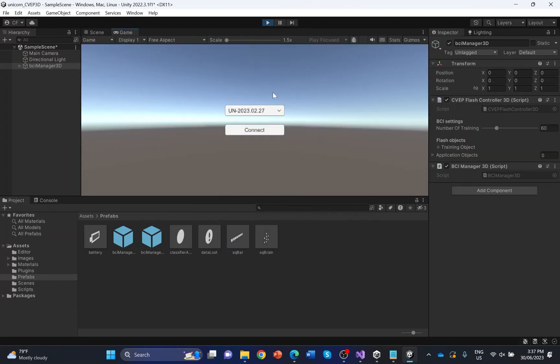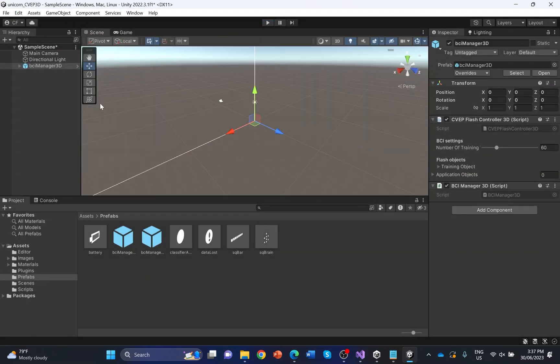You should see the BCI settings, as well as a dialog for training and application objects. To implement a BCI, you will need a training phase where the system is adopted to your individual brain signals, and an application phase where you can control the game with your brain signals. This Unity interface implements a visual paradigm. Therefore, you need some flashing objects to present the visual stimuli.